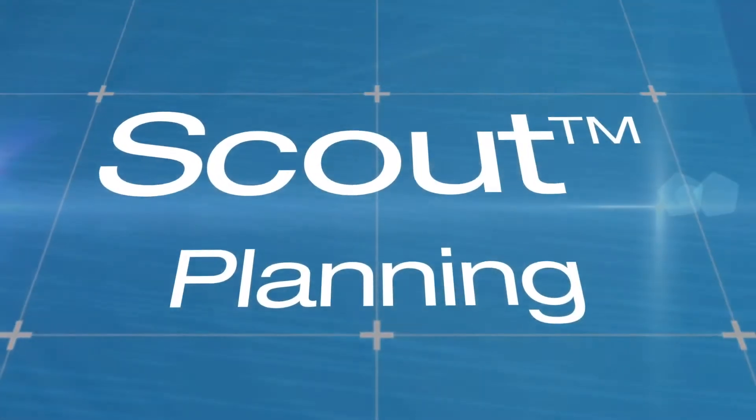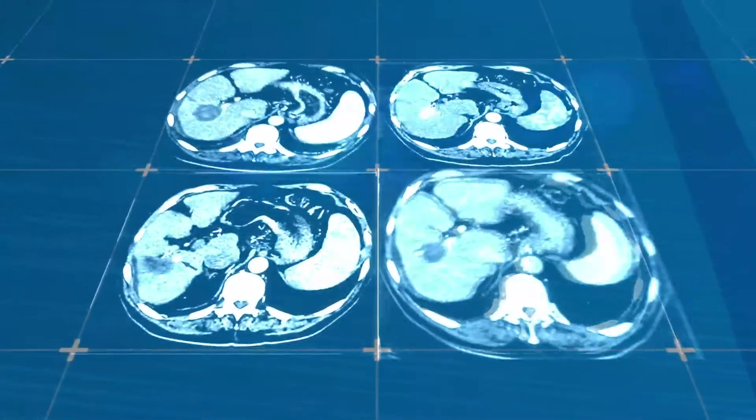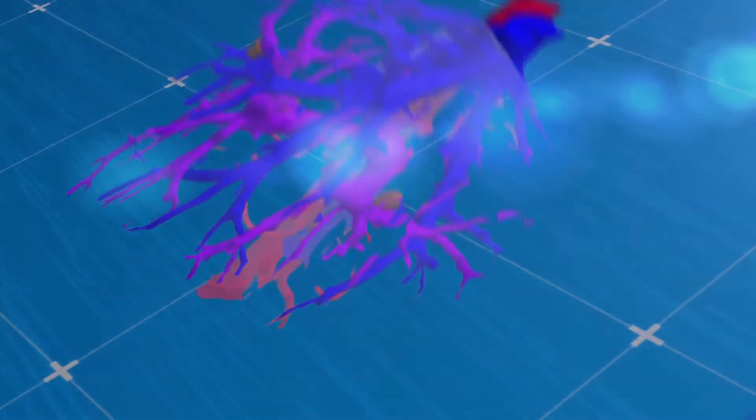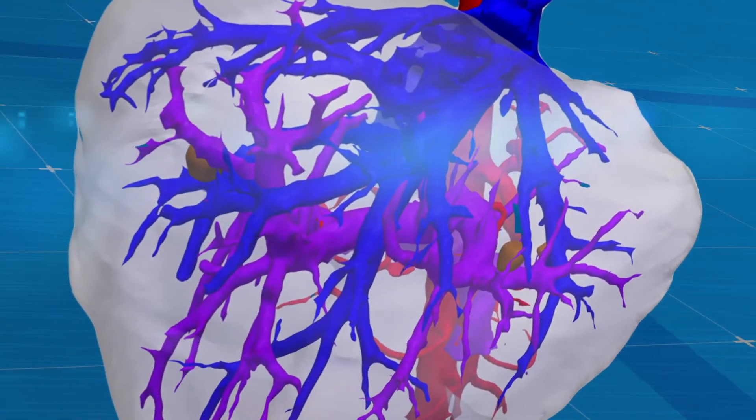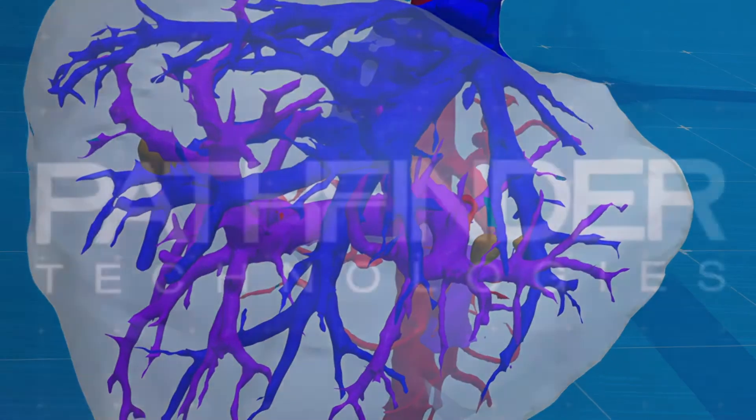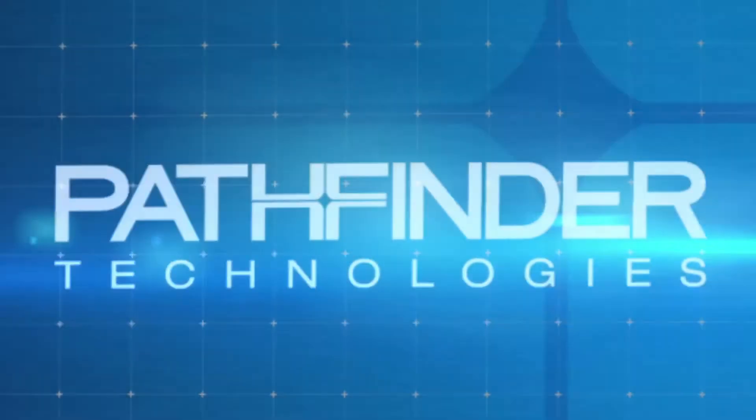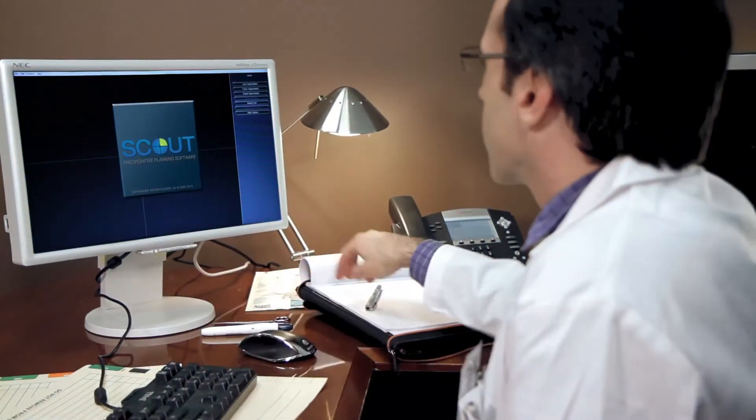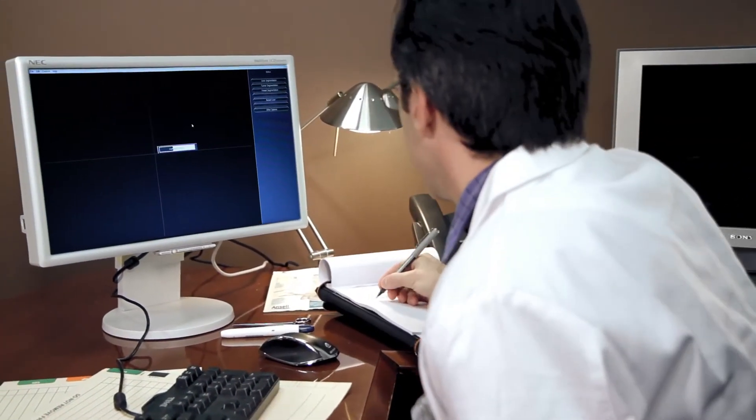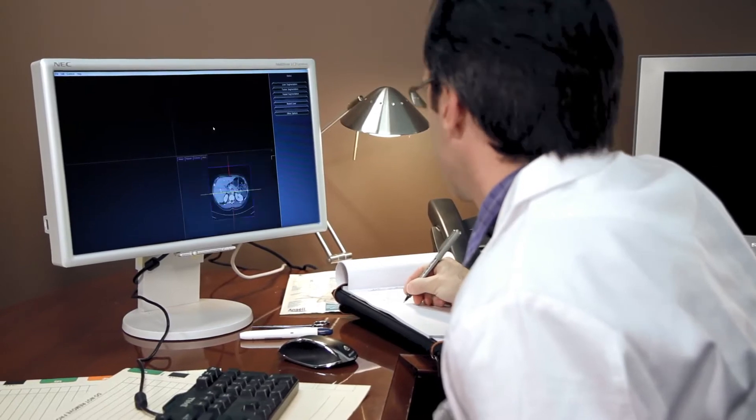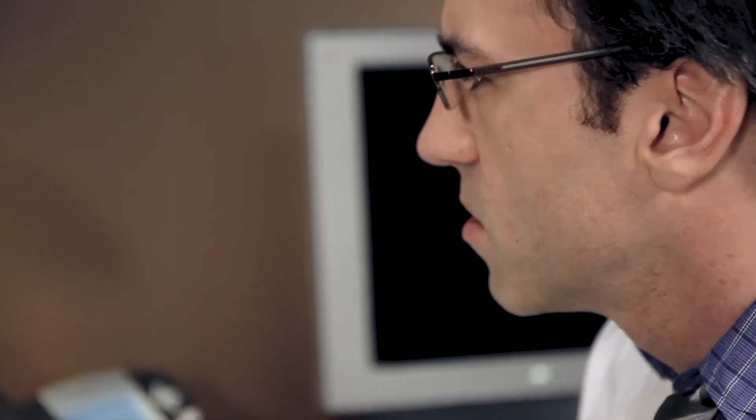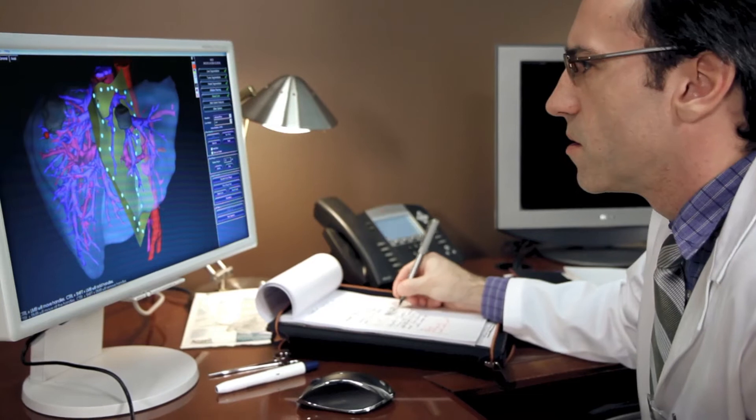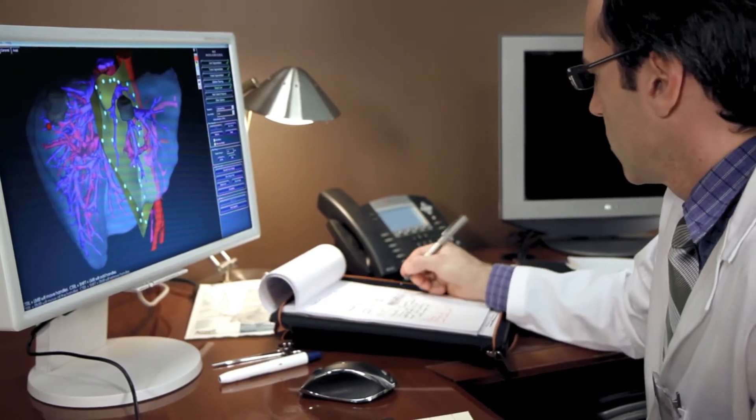Scout planning software takes a patient's preoperative CT or MRI images and builds a three-dimensional model of the target organ, enabling a surgeon to visualize the precise location of a tumor and surrounding sensitive blood vessels, and then to plan the best trajectory for surgery. Scout also provides instantaneous volumetric feedback for surgical resections, helping a surgeon determine the most optimal plan for each patient.